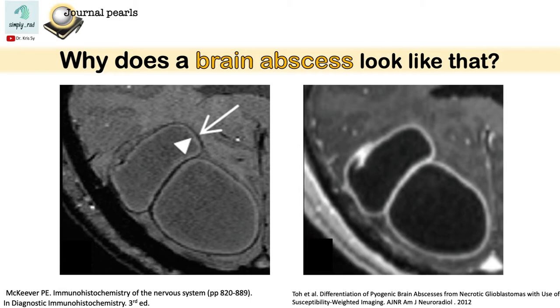This outer hypo-intense rim on the SWI image corresponds to the enhancing part of the granulation tissue.